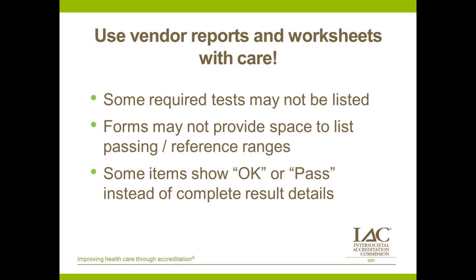A big problem with a lot of these report forms is that they don't have spaces to list out the numbers and the ranges. And quite often this is not because the numbers don't exist. It's because there are things that are documented internally by the service engineer within the company's software and documentations and logs, and then there's a customer report which is provided to the MRI facility, which doesn't contain all of that same level of detail. So this is something that we're going to come back to here in a few minutes, but I want to point this out too.